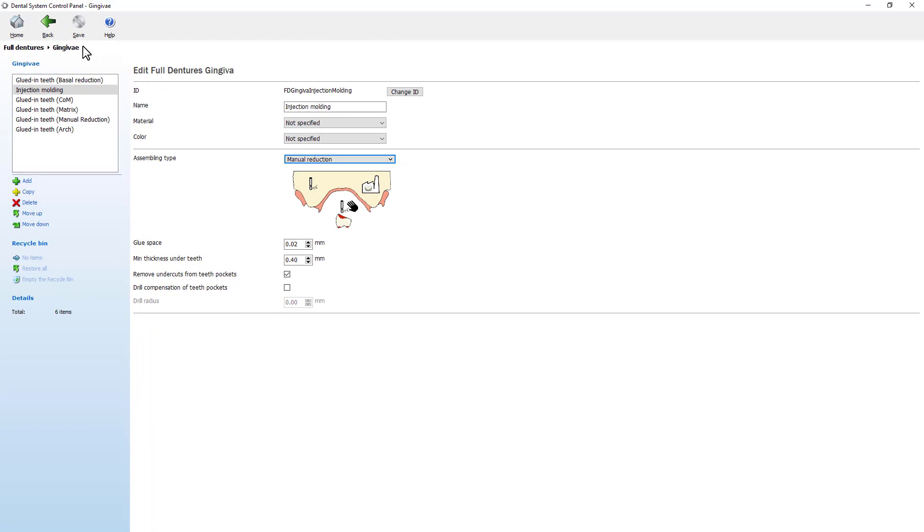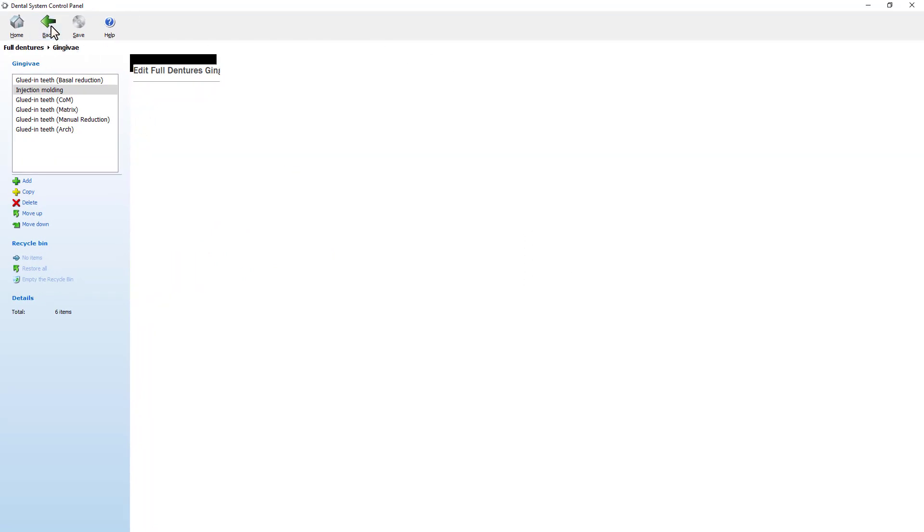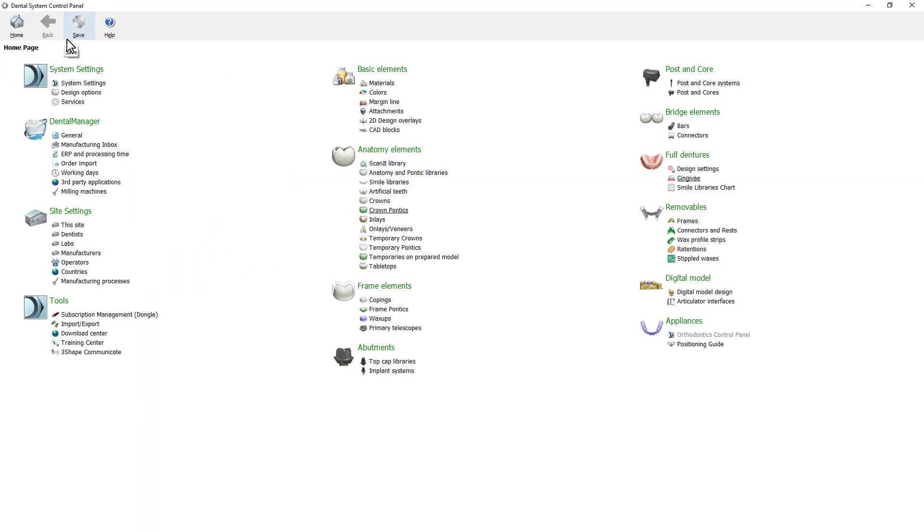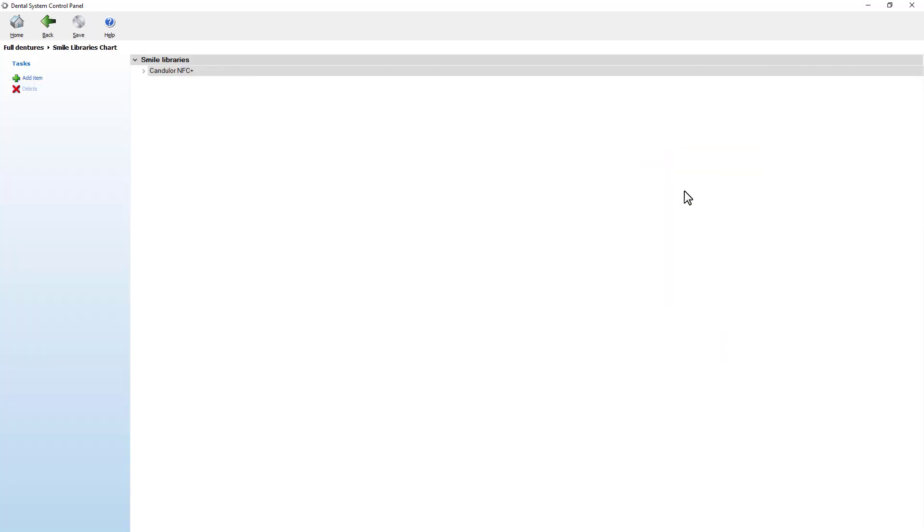Now go back to the main control panel page. The last option for the full denture is the smile libraries chart. In here you will see the list of available libraries.